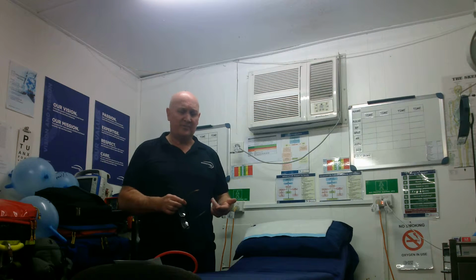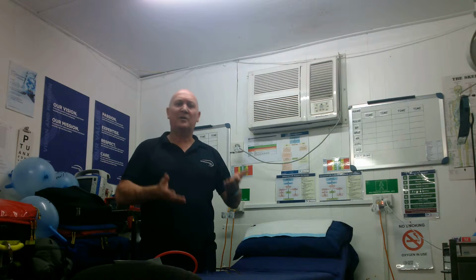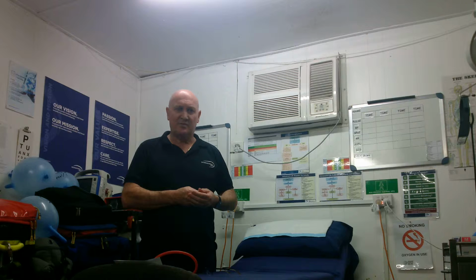There are complications. You can get hematoma, arterial spasm, arterial occlusion, and more bleeding, where pressure may have to be applied for about 5-10 minutes to stop the arterial bleed. So from the information that we've gathered, we can then work out what treatment we're going to implement. So maybe increase oxygen therapy, increase ventilation rate, increase drug administration, fluid administration. And then we can monitor those trends by taking blood gases regularly.